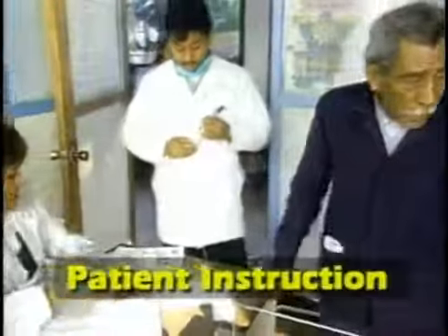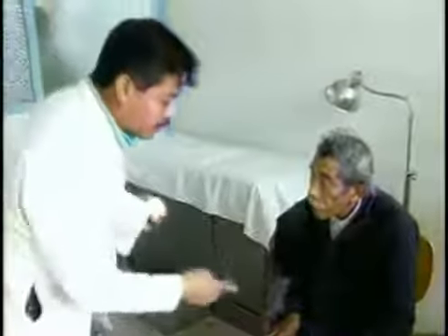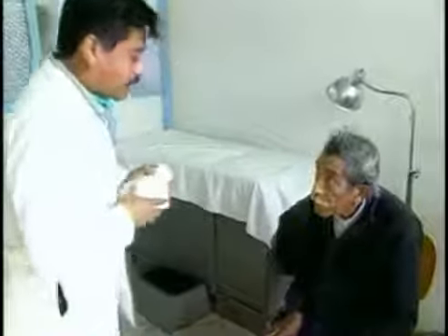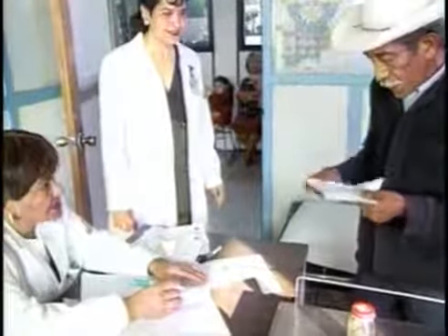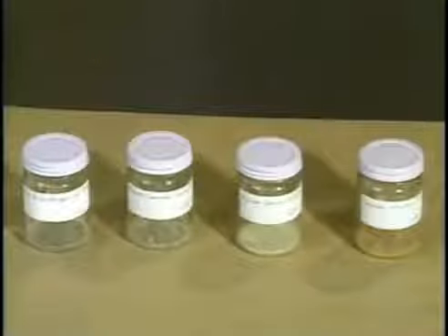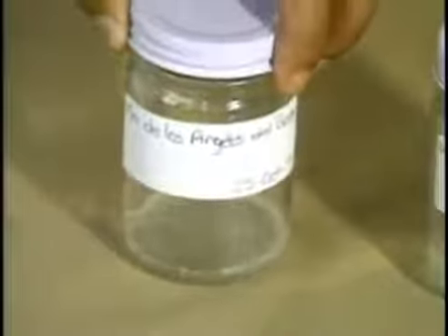For best recovery of tubercle bacilli, collection of 3 specimens is advised. At least 1 should be an early morning specimen. The patient should be properly instructed to ensure that the collected specimen is of sputum, not saliva. Clear saliva or nasal discharge is not considered a suitable specimen for TB. Nevertheless, they should be processed. Specific instructions for collection can be found in the TB program manual.